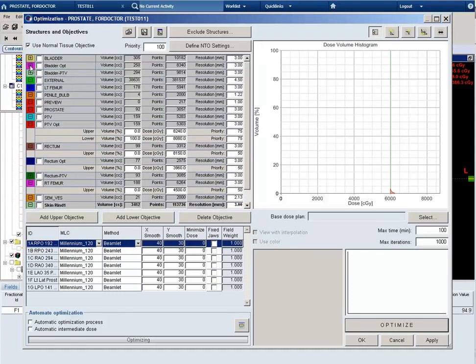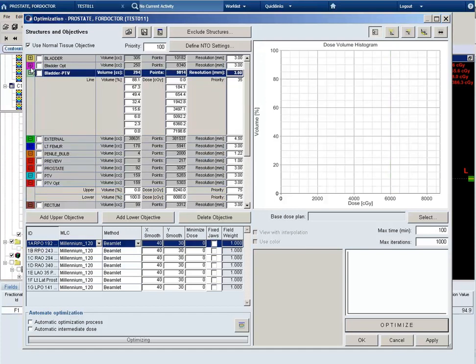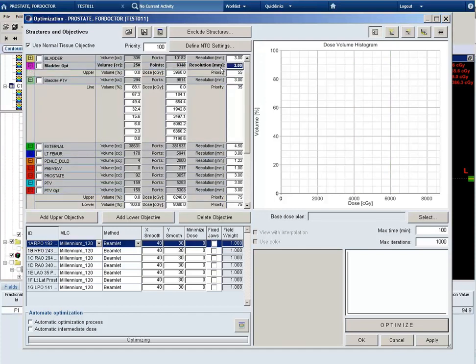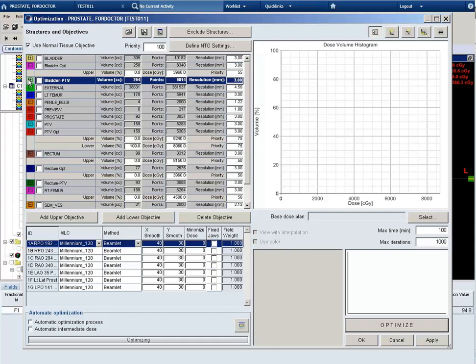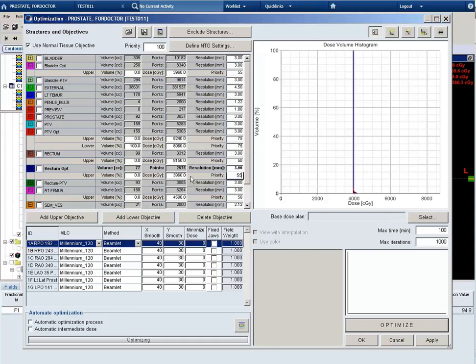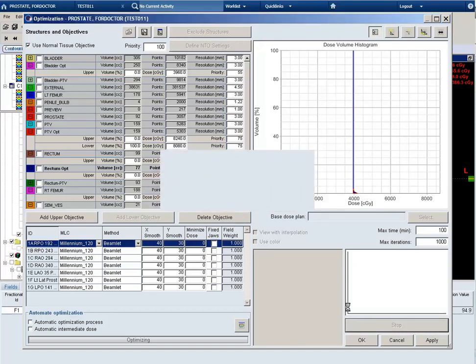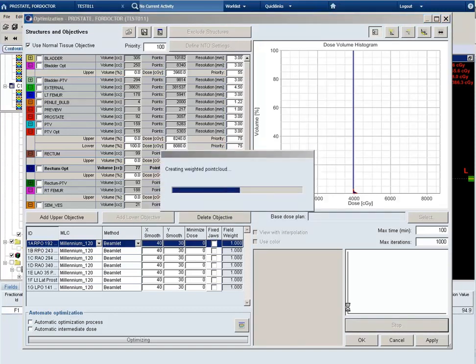And lastly, I'm going to improve the conformality of the 50% isodose line by increasing the priority on the bladder opt and the rectum opt. So I'll change the priority from 50 to 55. We want to see if we can make this any better. And this completes the second optimization for an IMRT prostate plan.